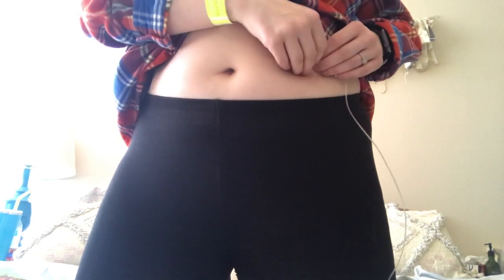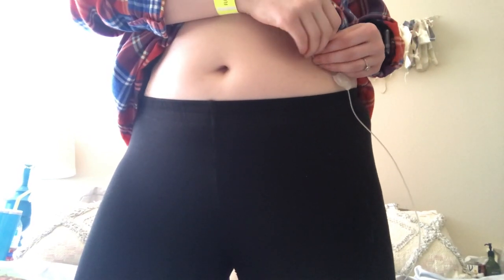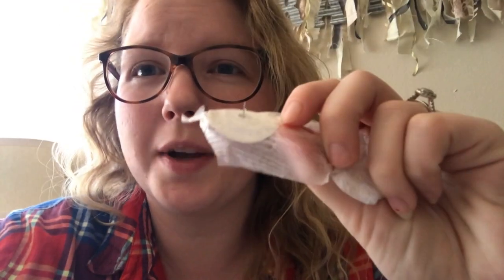So I just attached it on with some extra adhesive to make it last longer. I'm just kind of lifting up around all the edges and then I'm going to pull it directly out since there's a needle in it — just pull out. And now my tummy's clean.